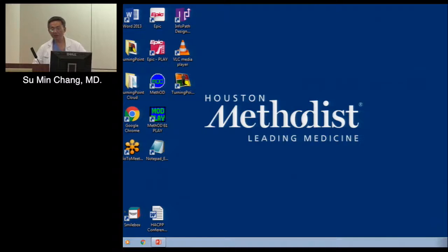Okay. So before I go to this advantage, I want to show you what 3D display is, because you all heard about 4D CT, and now all the valve services want to send the patient here. We want 4D CT. It sounds like something invented in 2015 and brand new. As a matter of fact, academic radiologists have been doing that for probably two or three decades. All you do is you have a 3D display, you obtain different parts of the cardiac cycle, and you play it. That makes a time-resolved 3D display. That's called 4D CT.